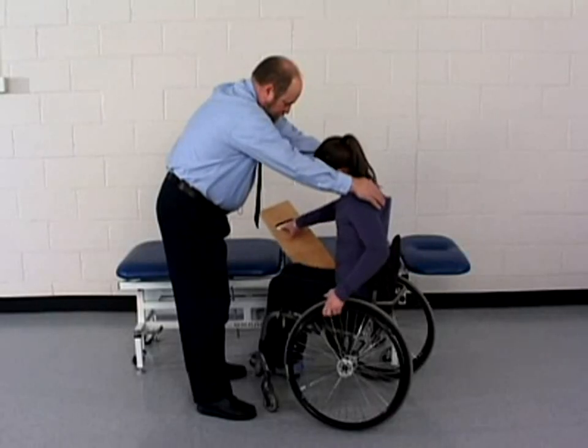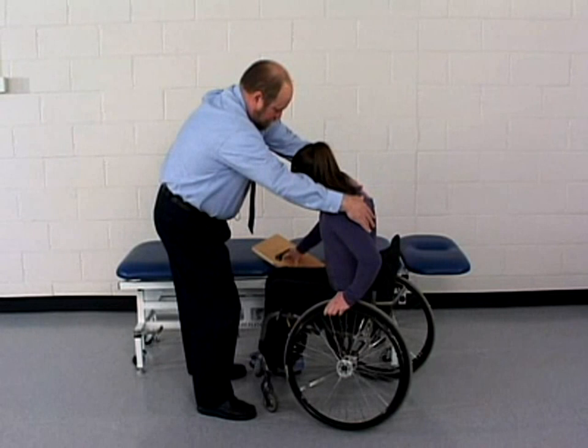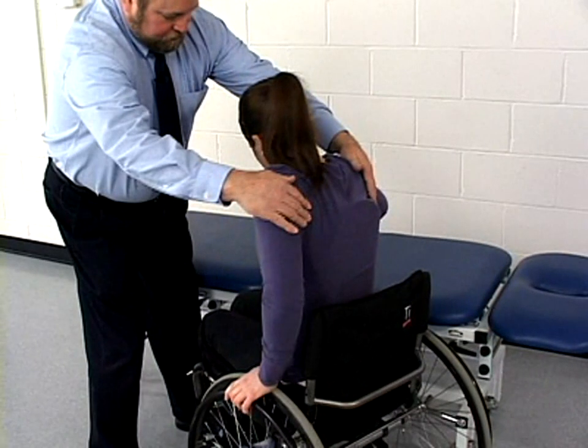The patient leans away from the treatment table so that the sliding board can be placed well underneath her buttocks. Take care not to pinch the patient between the sliding board and the wheelchair seat. The patient then returns to the upright sitting position with the buttock nearer the treatment table resting on the sliding board.